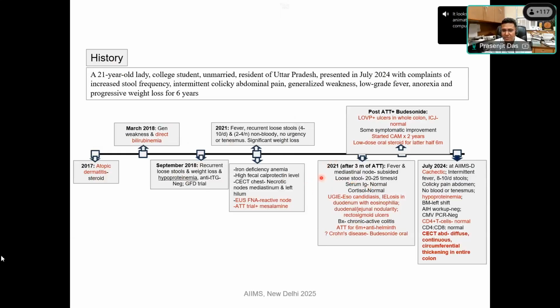Then in 2021 and onwards, she also had small bowel disorder, which, because of this increased IELs, was once thought to be celiac disease, but did not respond to GFD. Also thought to be TB, someone reported outside, looking at the altered architecture as possibly tuberculosis, she was mistreated with ATT, then as Crohn's because it is a chronic disease, but the disease kept on progressing. Can you see? The ulcers and everything became deeper and she became very ill.